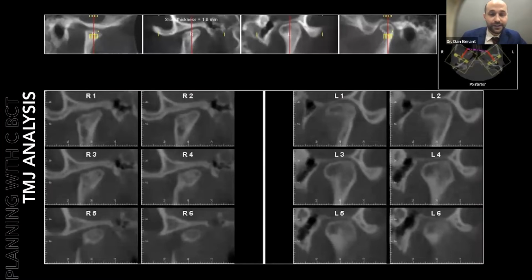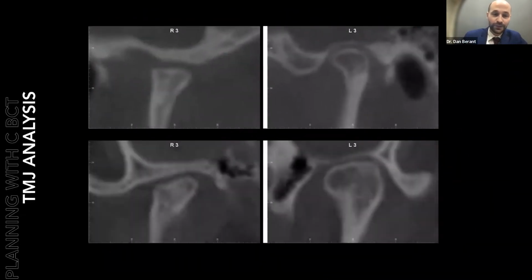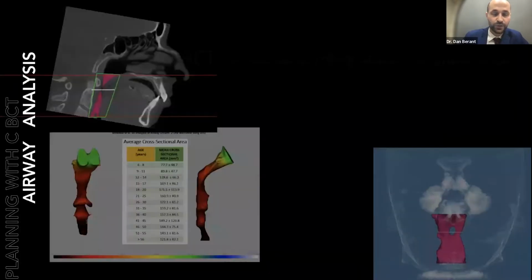Now, we could talk a lot about jaw joints, but when a patient comes to you with a concern of jaw, you do the initial TMJ analysis. The beautiful thing about a CBCT is it allows us to see in far greater detail than a pan on its own. And so the topic of tonight is not to talk about TMJ disorders, but what we do look at is, even though we see the beaking and that this patient has some level of disc condylar resorption, the cortical layer on top is indicative that the resorption has ceased and we are safe to continue with our treatment.